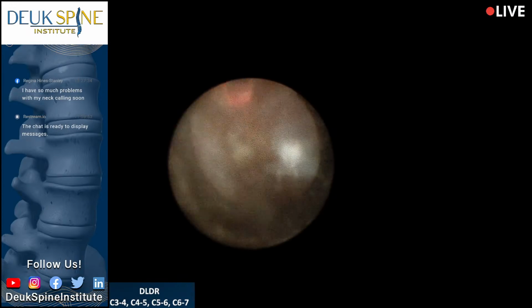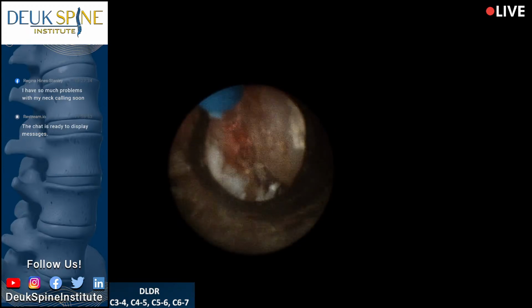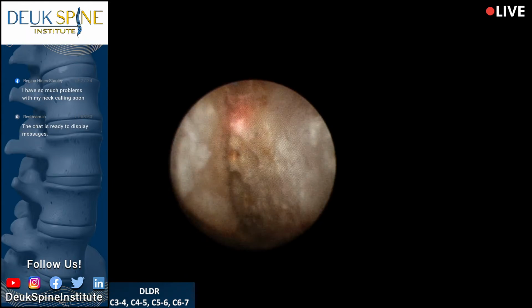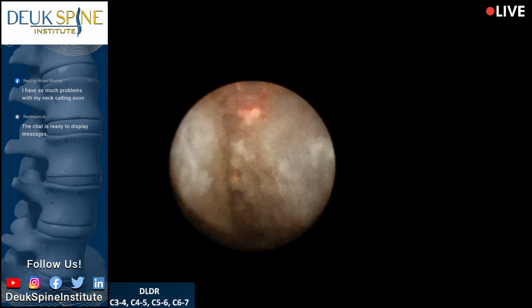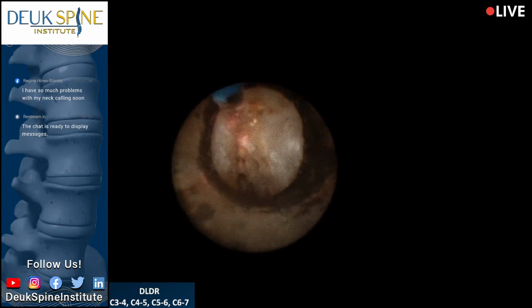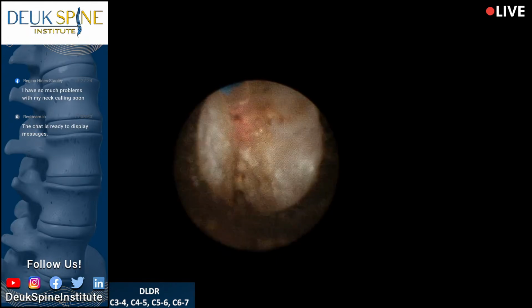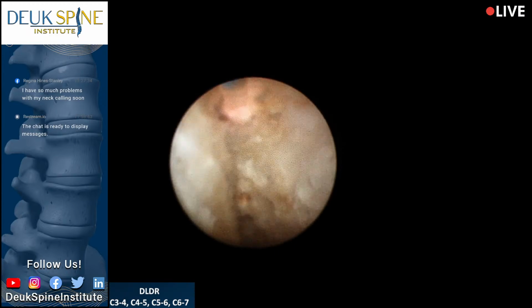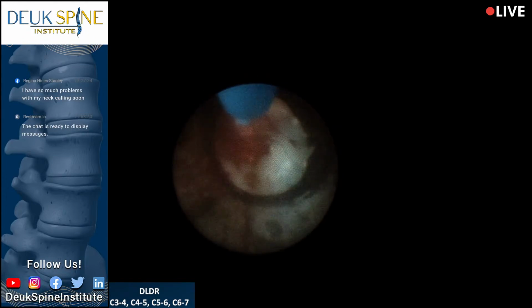Now, one thing he's going to have is more movement, because all that scar tissue that was holding these bones together, keeping them from moving, we've just freed it up. We've gotten now probably about 2 degrees of movement in this disc. So he's gone from 0 to 2. If I do that for all 4, then he's going to get 8 degrees of movement. Doesn't seem like much, folks, but when you're limited in movement, every little degree counts. You know? Every degree counts. Back to me.